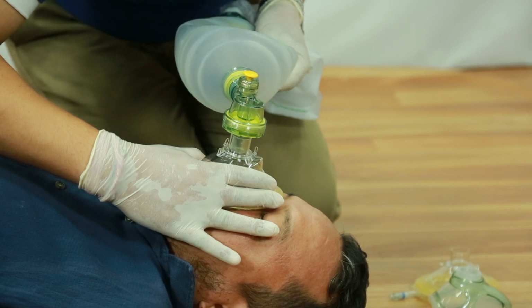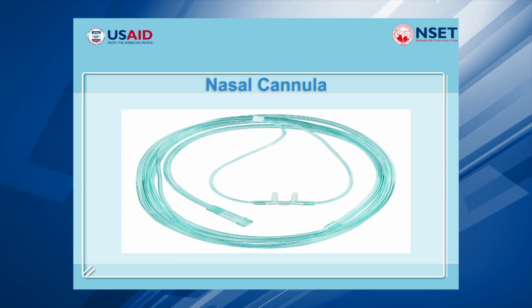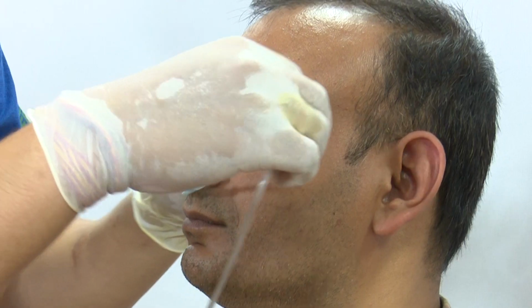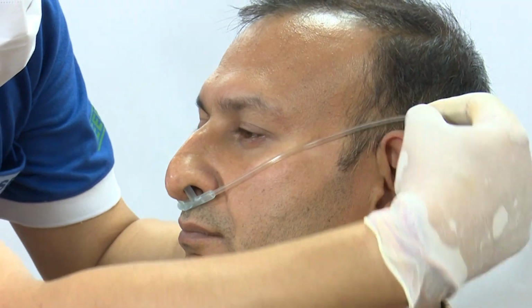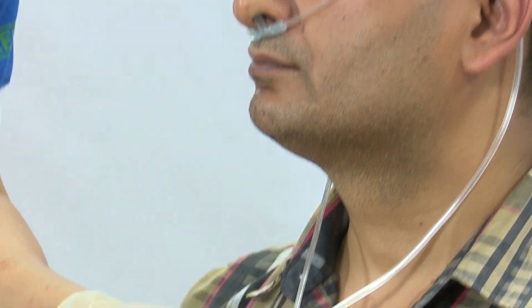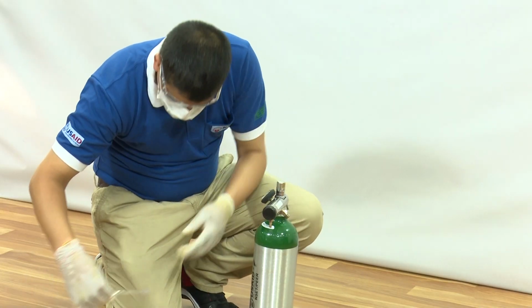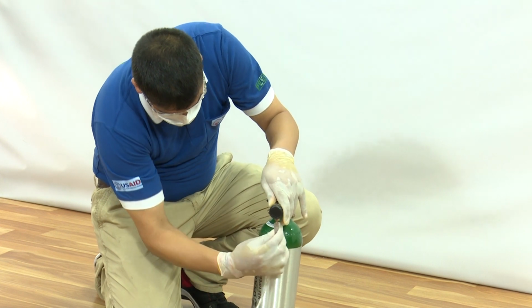Adjunct equipment for administering oxygen. Nasal cannula. It has 2 stems that are placed into the patient's nostrils. Used most often in a hospital setting, most patients tolerate it well, and it is the best accessory for administration for low concentration oxygen. Flow rate is 1 to 6 LPM.